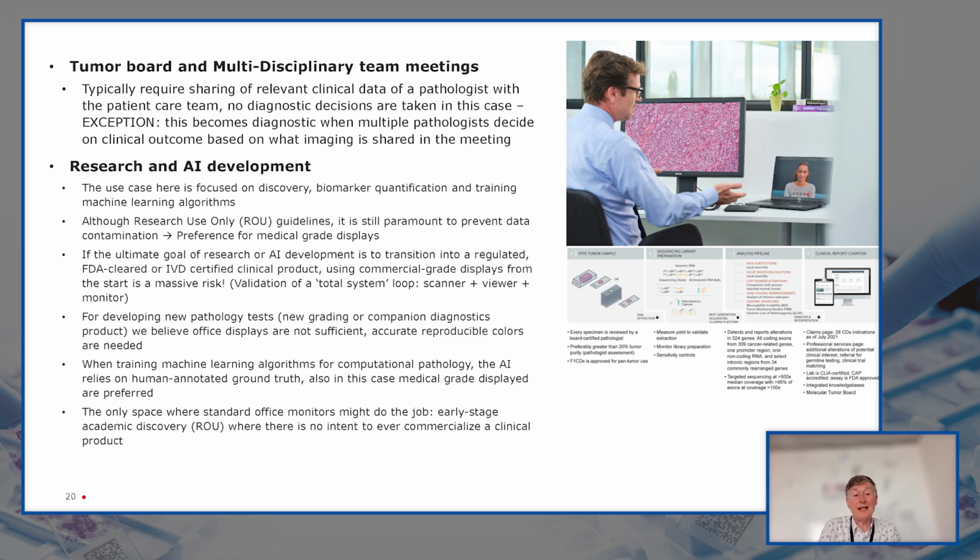In new pathology settings, like for example new grading or companion diagnostics, there also we believe that medical grade displays do make a lot of sense. Machine learning: if you're starting to annotate clinical AI data on WSIs, on images, there again, you're generating ground truth.